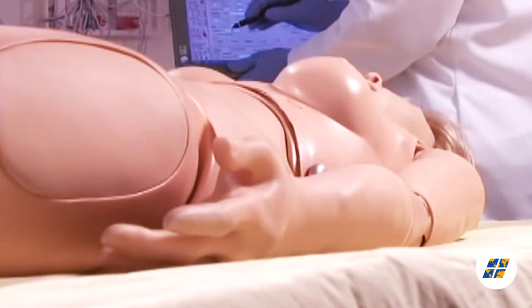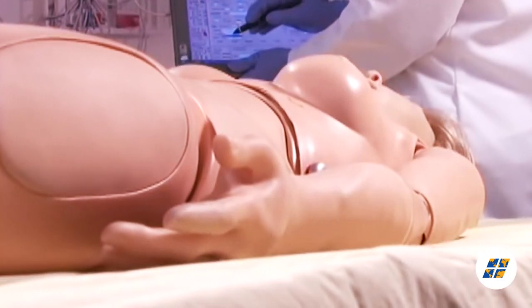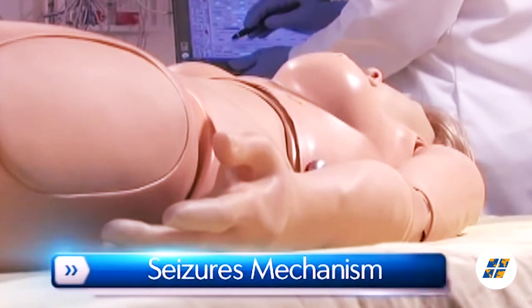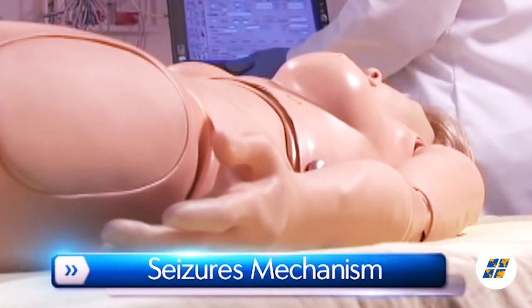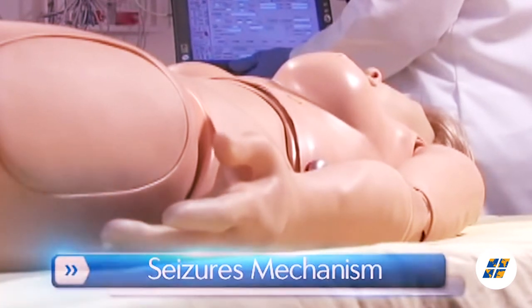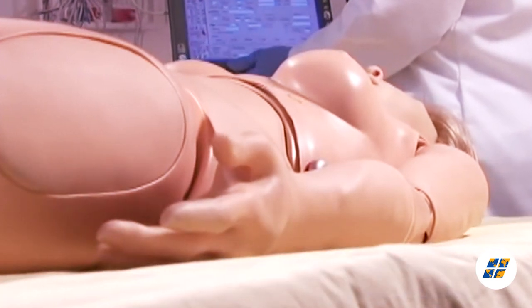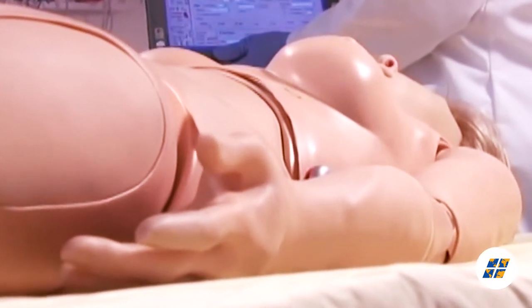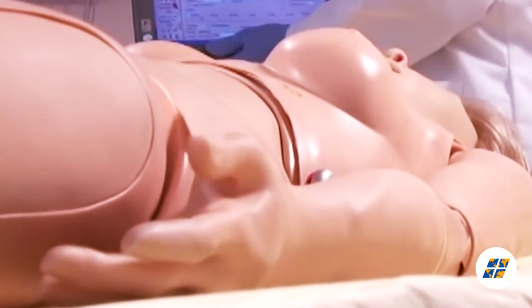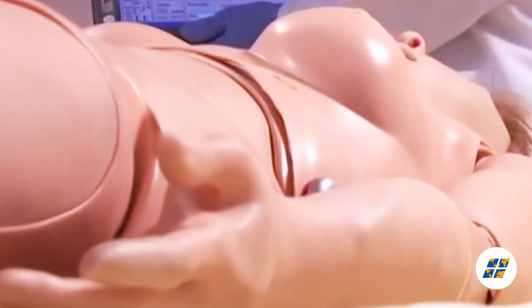Suzy is outfitted with a seizure mechanism that can be used in conjunction with scenarios. The severity of the seizures can be programmed with a touch of the stylus, and there are two different intensities to choose from.